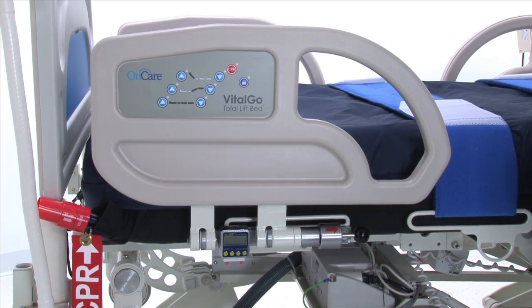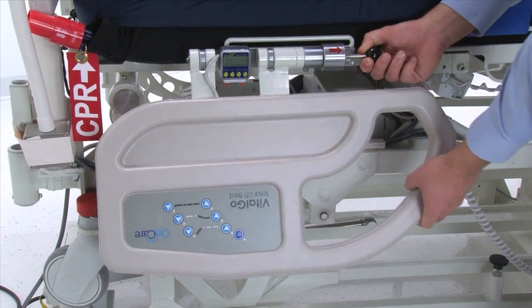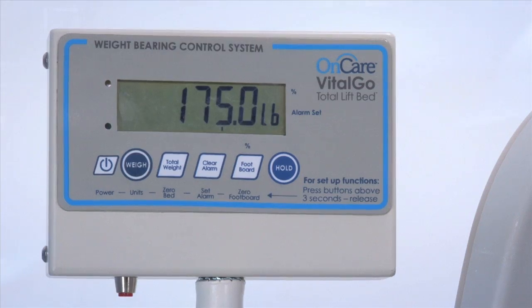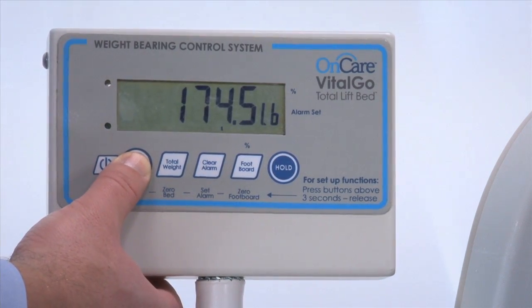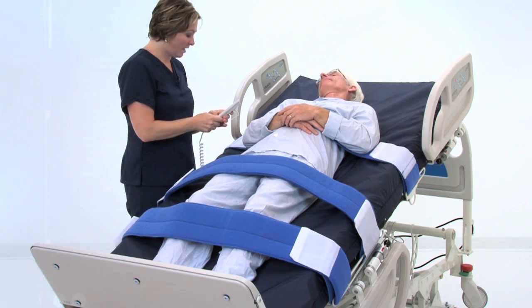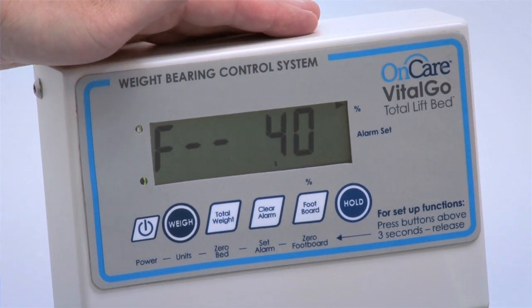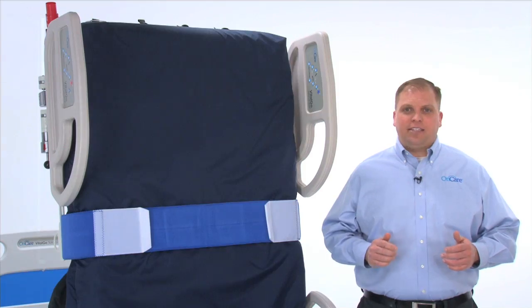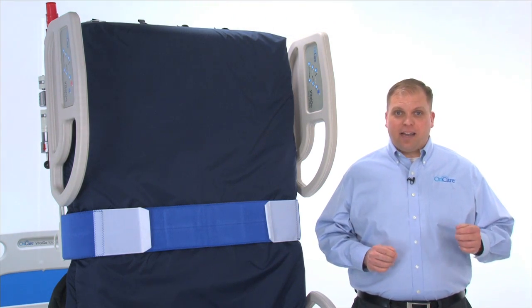The lockout control disengages functionality of the patient controls. The side rail can be positioned in two ways — fully up and down — and are in compliance with all current regulatory standards. The Total Lift Bed patient scale can be set to display the patient's weight in either pounds or kilograms. The bed is also equipped with a bed exit alarm.